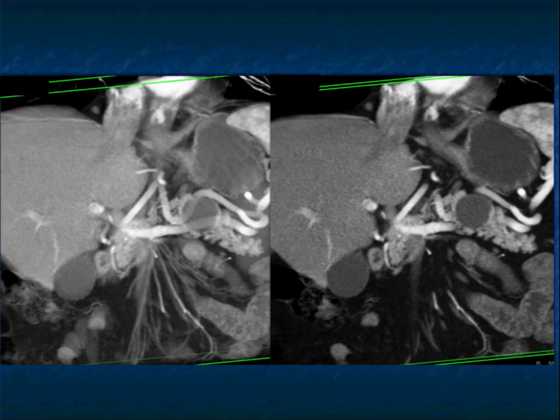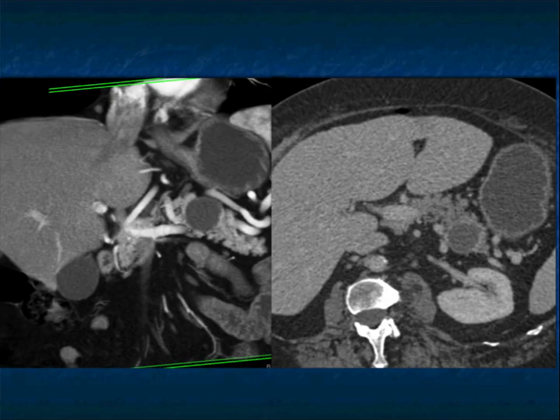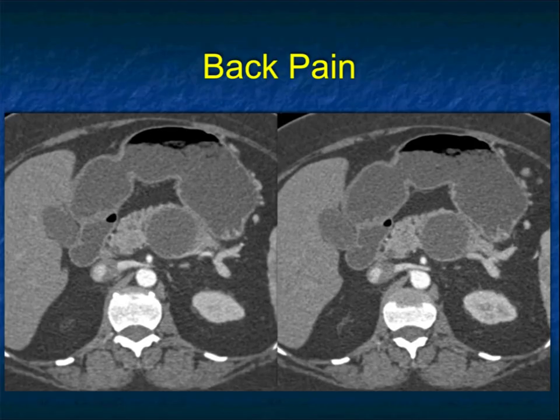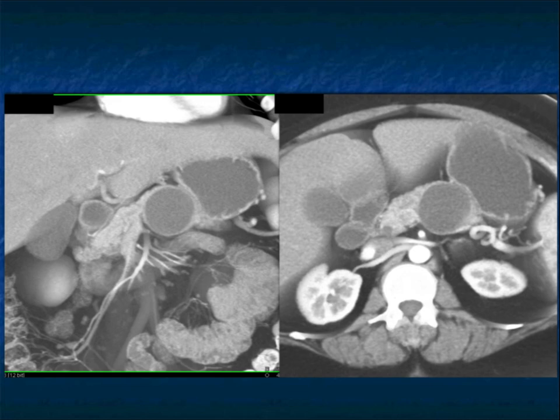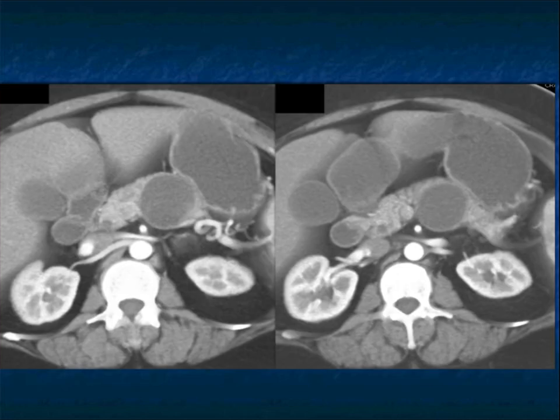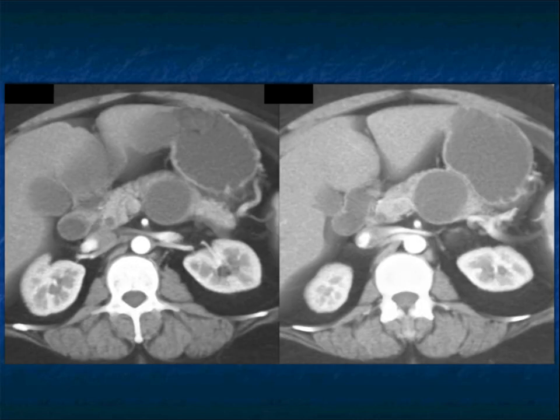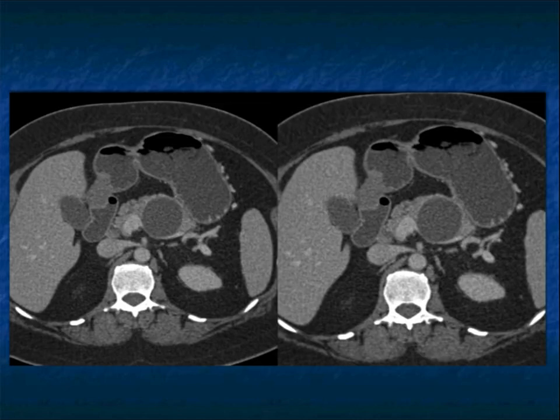I'll take you through the images, which show the very good definition of the cystic lesion. No septations in this case, no nodularity, no enhancement. Or this case — patient with back pain, that's why the patient presented. I don't think the back pain was related to the lesion. But there it is: classic location, body-tail junction, subtle rim enhancement, no true septations, no nodularity, no dilated pancreatic duct. This was an MCN.